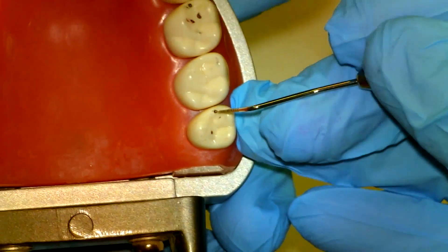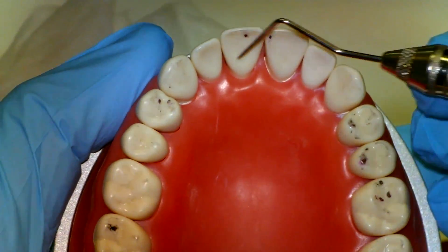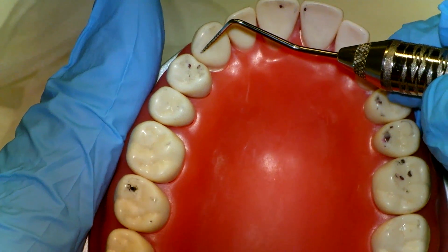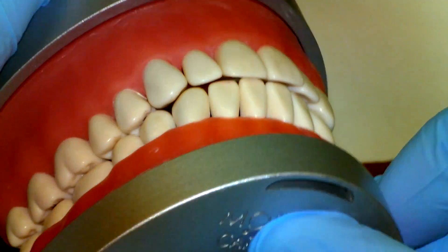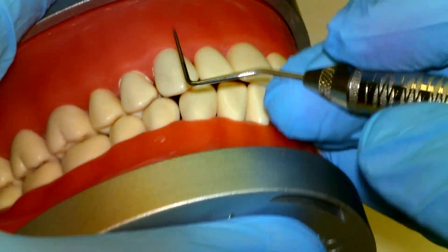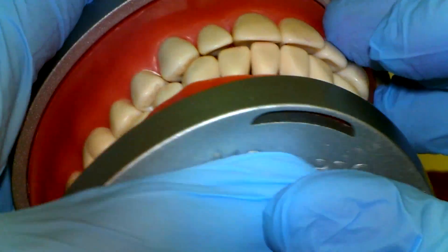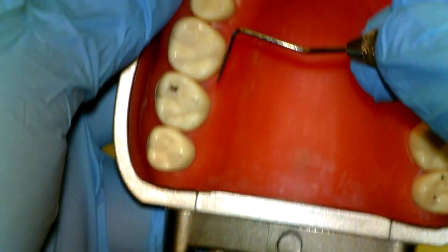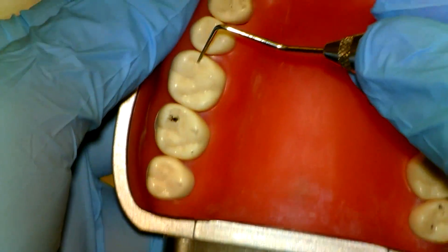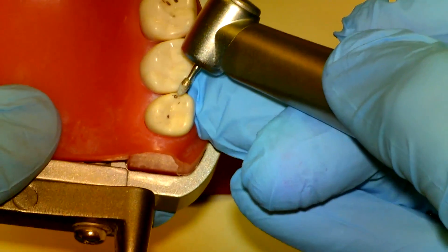We can re-mark everything now and go through this process again. We can see the anteriors are still pulling through, so we need a little more adjustment in the posterior. Taking another tour, we now have more marks and both premolars are now in contact. We still have a little marking in one area that we want to leave alone, and our canine mark has moved position. As you adjust one area, another area that wasn't in contact may now come into contact — if your dots move to a different position, that's normal and part of this calibration process.